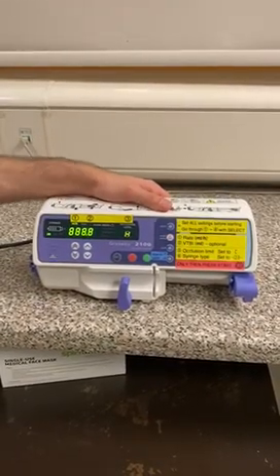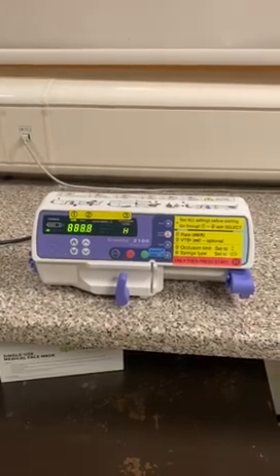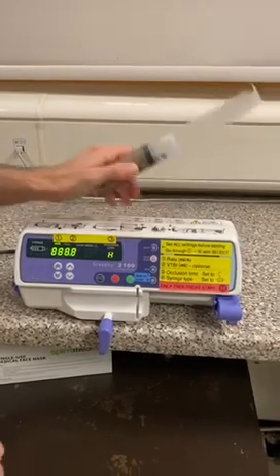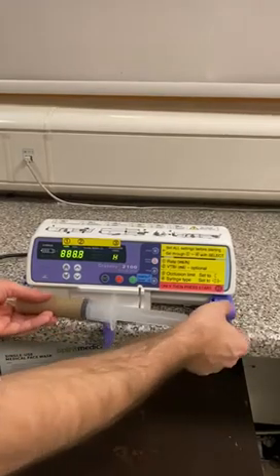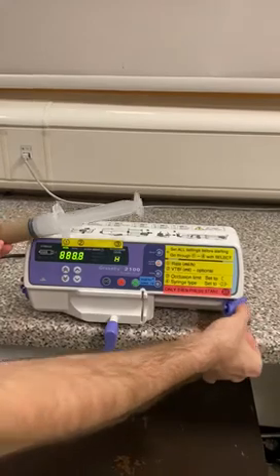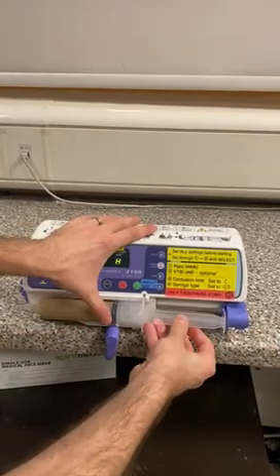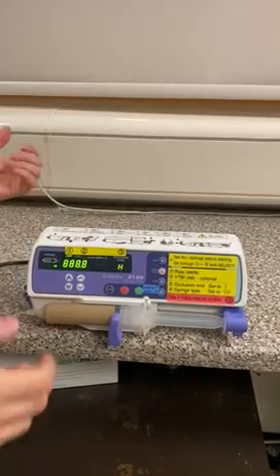Now we've turned it on, it's time to load the syringe. It's a little bit different from our normal pumps to load, so watch carefully. First, we have to open this clamp and we do that by pulling it out and turning it. Second, we need to line everything up so that the syringe slides in in one go. We're going to press this button underneath that releases the plunger — you see it moves freely now? We're going to line it up exactly with the end of the syringe and push it in all at once. Then we can close the clamp and we're ready to set up.